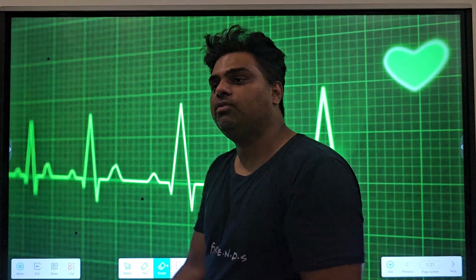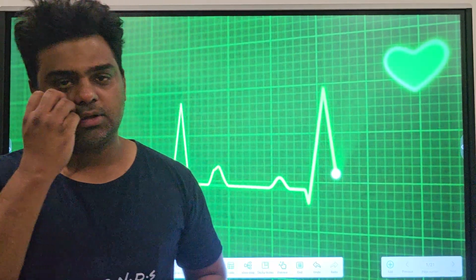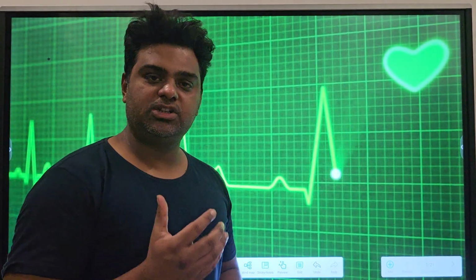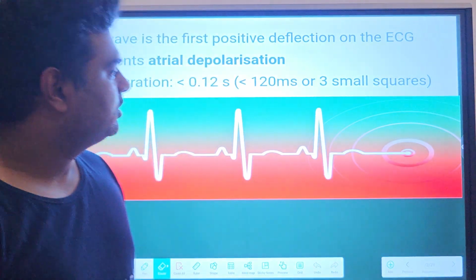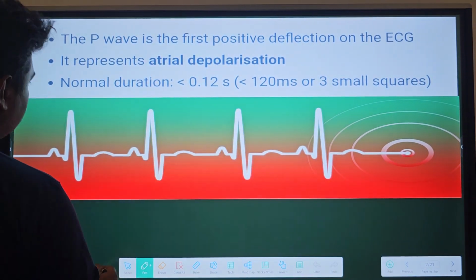So, good morning, friends. We will be starting a series of lectures on ECG. This will be the first lecture, and it will be followed by around 20 to 30 lectures. We will complete every aspect of the ECG. First we will understand some basic concepts regarding ECG.